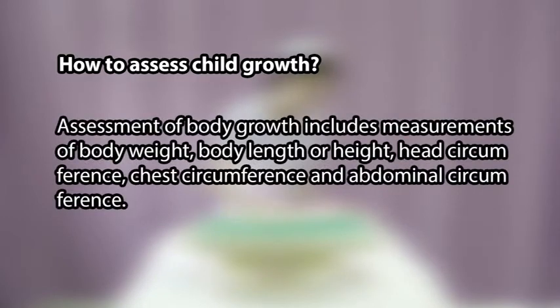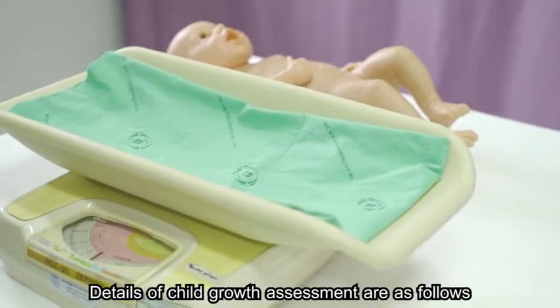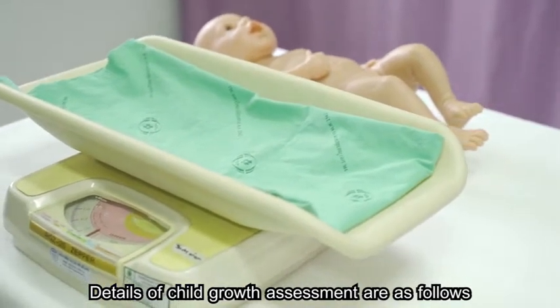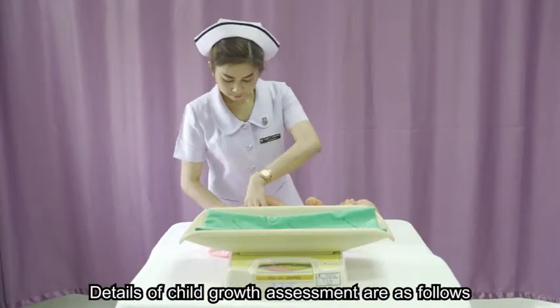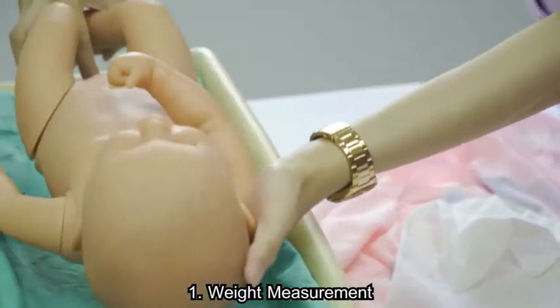Assessment of body growth includes measurements of body weight, body length or height, head circumference, chest circumference, and abdominal circumference. Details of child growth assessment are as follows. 1. Weight measurement.